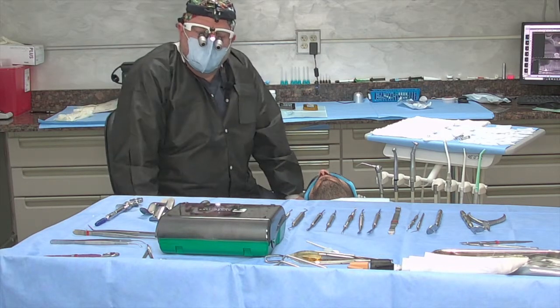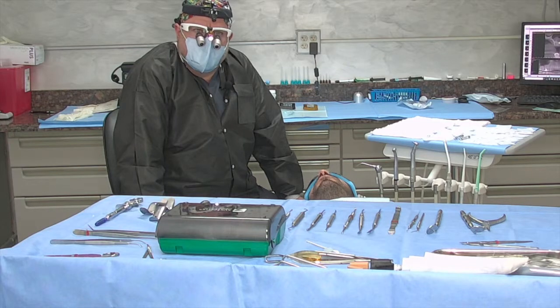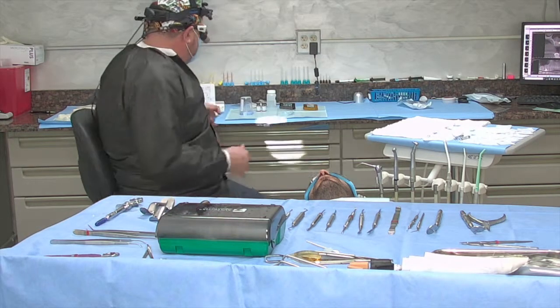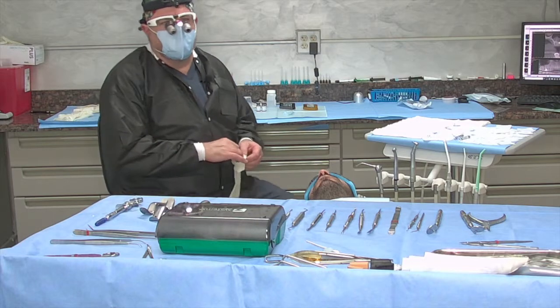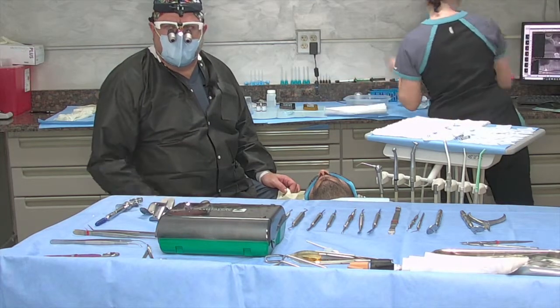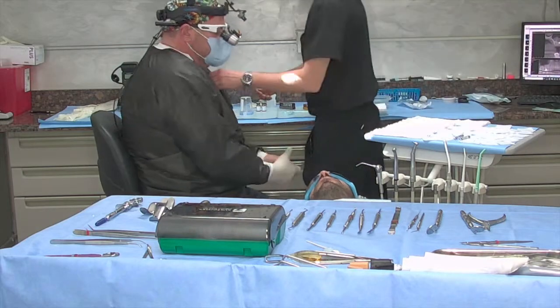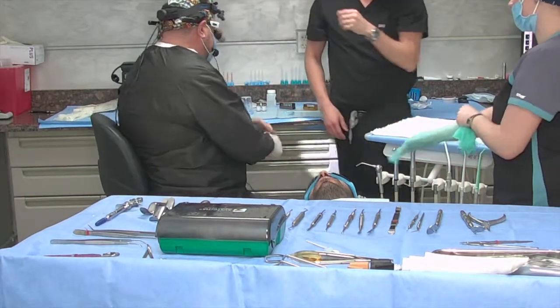We're going to be placing a 5 millimeter by 10 millimeter Z Systems 2-piece implant. We'll be placing a healing cap for healing. And we'll be doing an internal sinus lift, as I said, so some graft membrane first prior to the implant being seated. We've got 8 millimeters of bone, so this is very straightforward and easy. There's no reason to make a lateral window.